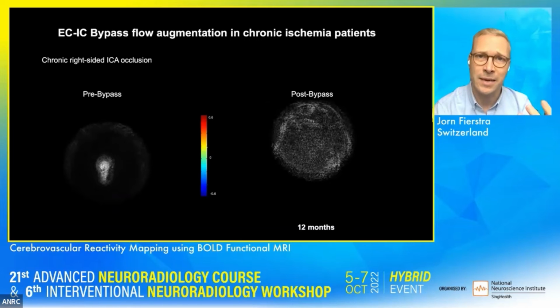But this is also the nice thing, as I said, for a clinical BOLD CVR, since you can now do sequential follow-ups. You could also do it every 6 months. It's not a technique that is not available in the clinical setting. I just chose 1 year because it would be our follow-up standard operating procedure or workflow here at the University of Zurich.